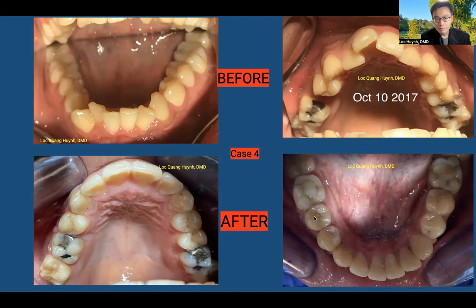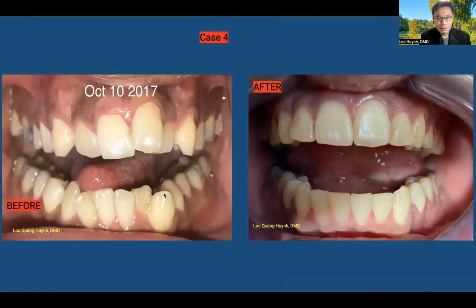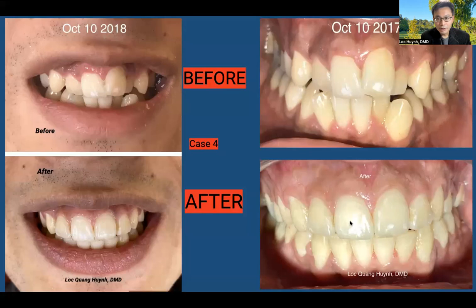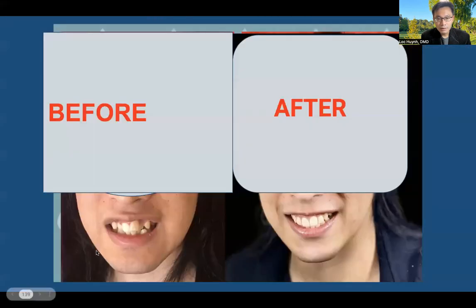That's how we ended up done. This is the facial intraoral photo. You can see the old wear and tear on the enamel — we did enamel remodeling for him. Very difficult case — not simple, not easy to work on. Very tense, very conscious and quiet, very difficult to communicate. But this is how we finished, from before to after. The patient became more confident and a happier guy.